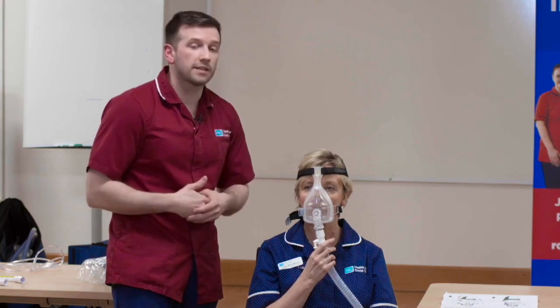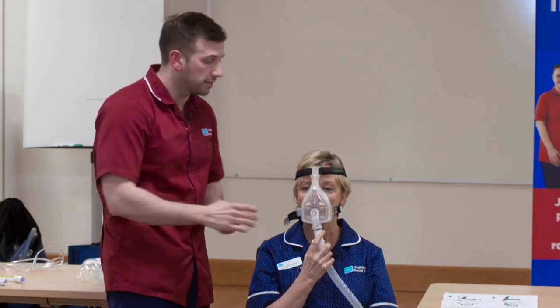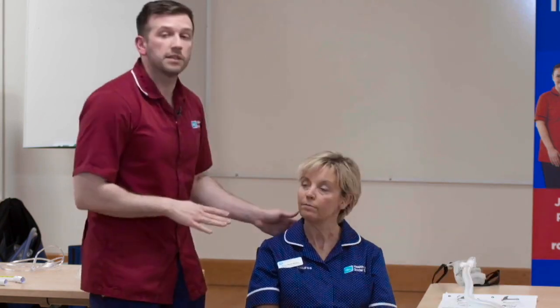In removal of the mask, as I say, we've employed the strategy that you would switch the ventilator off at this point, and then you would remove the mask as so. It is important at this point to recommence the patient back onto whatever oxygen therapy they were on before they started the non-invasive ventilator, whether that be nasal cannula or an oxygen mask.